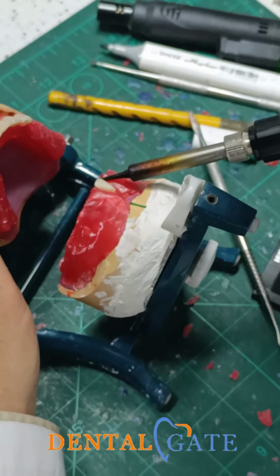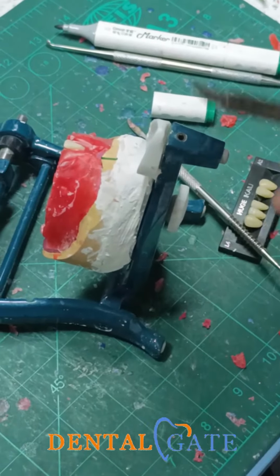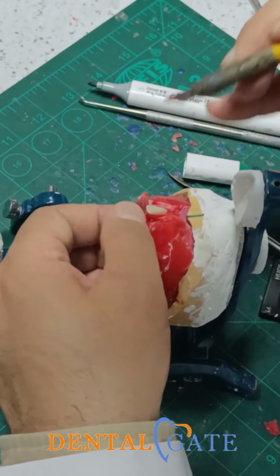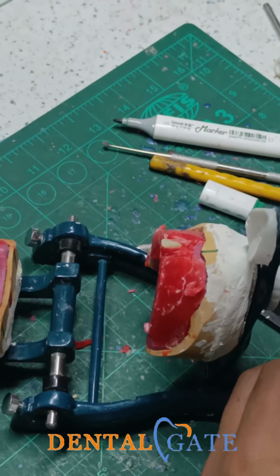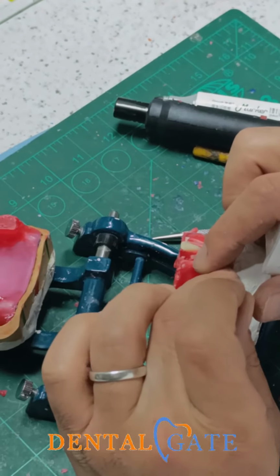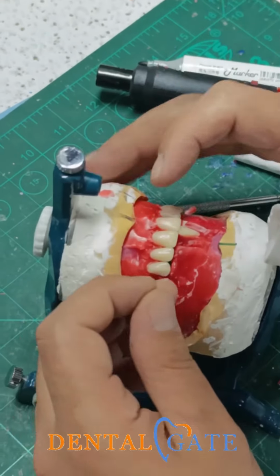Don't make a lateral now. Just be sure to perform the midline within the lower teeth. After that, I will start with the lateral. So remove a sufficient amount of the wax and start to put the central incisor in the same position, with the same criteria, to preserve the midline, because the midline should be ended at this stage, okay? Because we had a midline within the upper, so we need to perform the midline with the 4 anterior teeth, okay? For the lower and the upper.